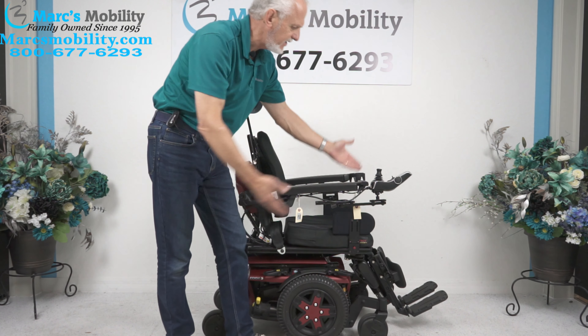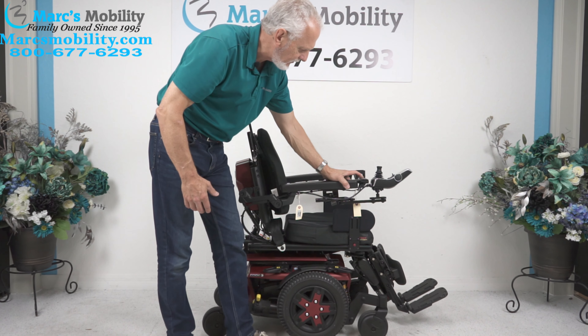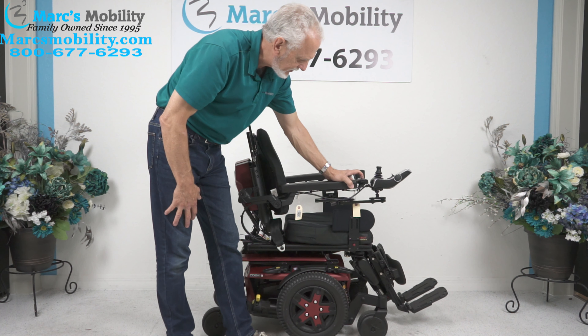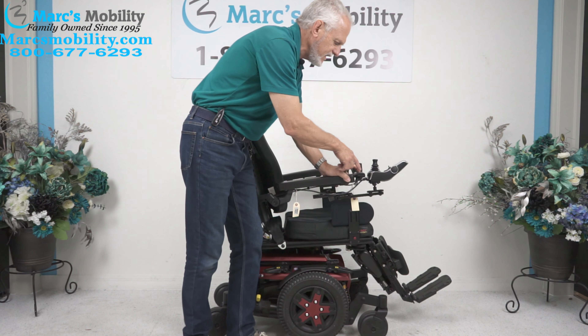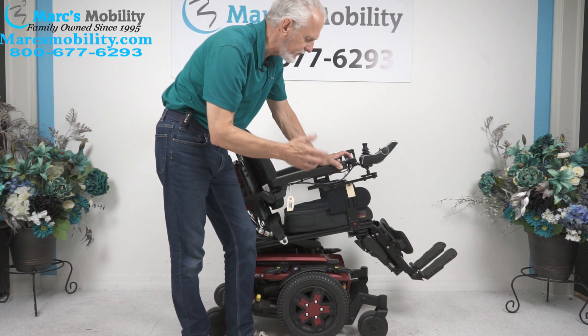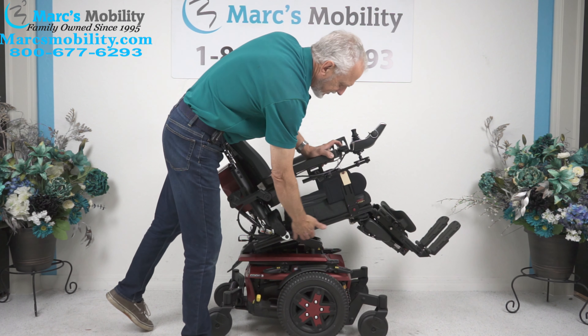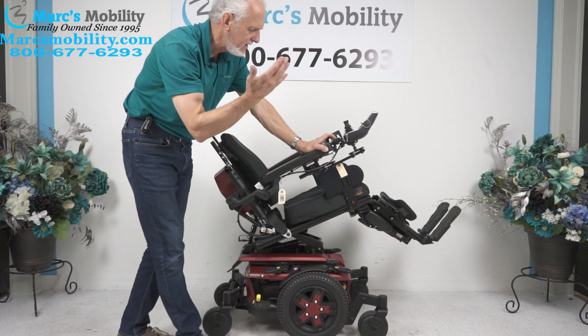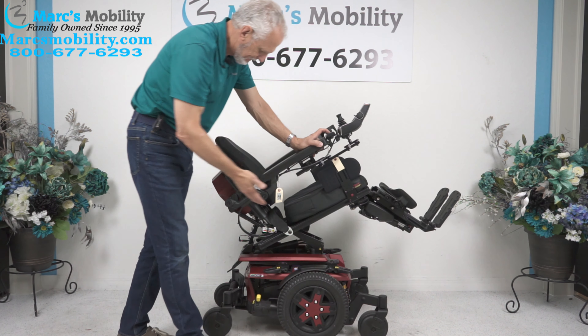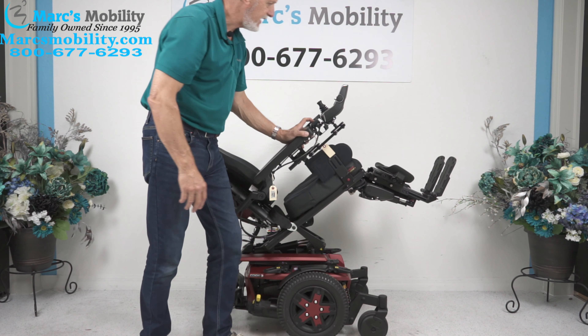The first function I'm going to do is the tilt, which is the first button on here. If I hold that button down, the seat will start tilting back. On these, you have to hold it down for at least a second before it responds — it's not a quick response. You've got to hold it and then it'll go. This is called the electric tilt. When the bottom goes back, it'll take the legs and the back, because they're all connected together.